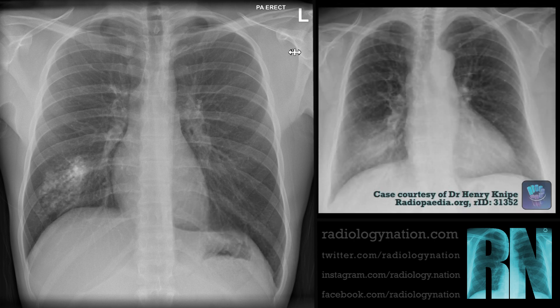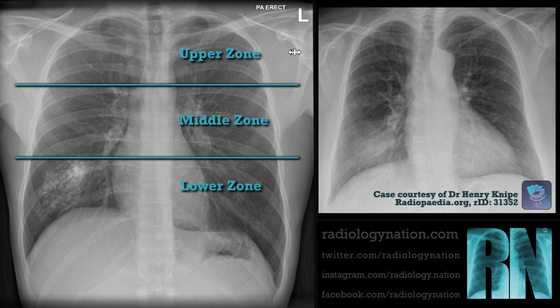Difficulty in lobar localization can arise when the consolidation does not extend to the mediastinal or diaphragmatic surfaces, as demonstrated in this case. In these situations, simply describe which zone of the lung contains the consolidation, as opposed to the lobe.